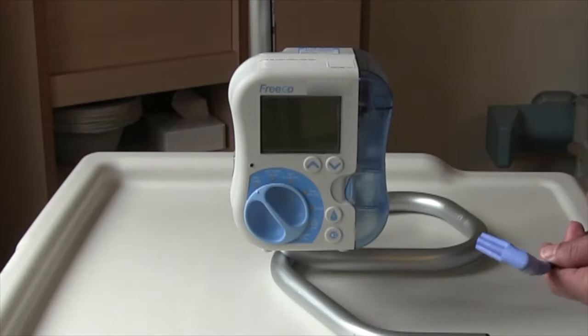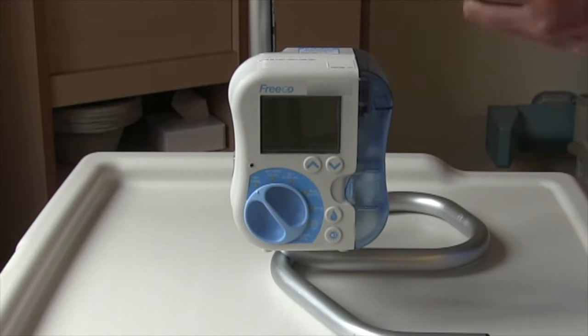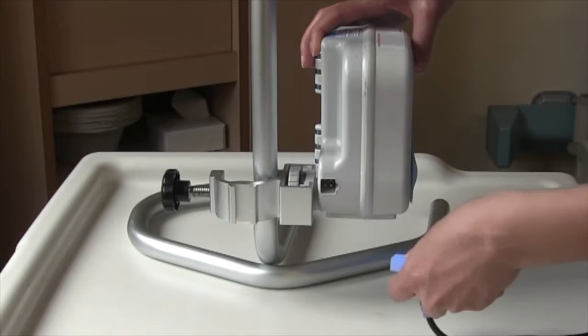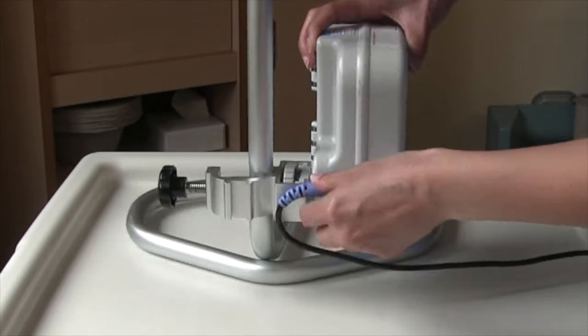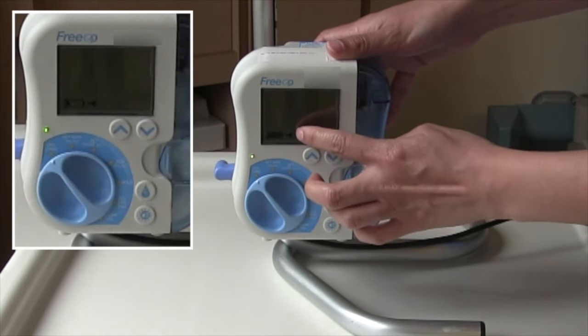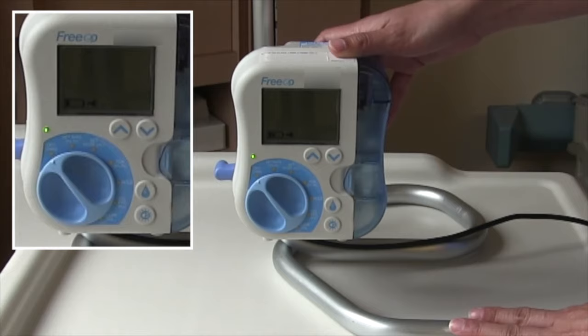To charge your pump, place the end of the battery cord into the side of the pump and plug this into your main outlet. Once your pump is plugged in, you will see a battery symbol on the left bottom screen, indicating the pump is charging. Once the pump is charged for six hours, you will have approximately 24 hours of battery life.